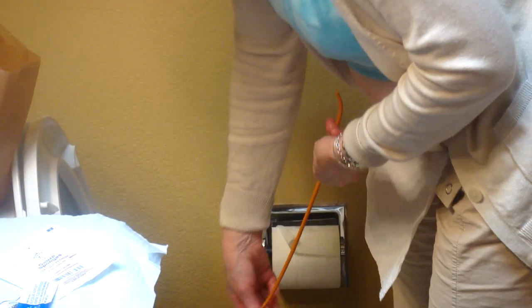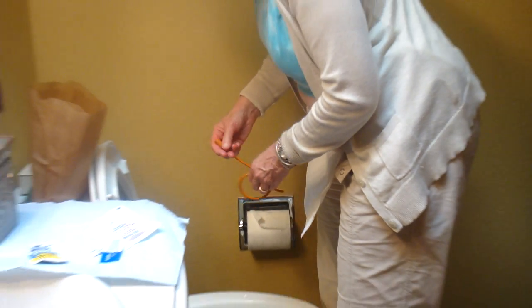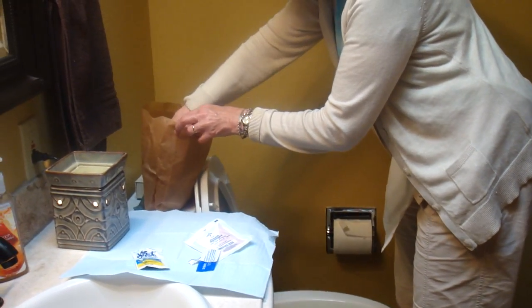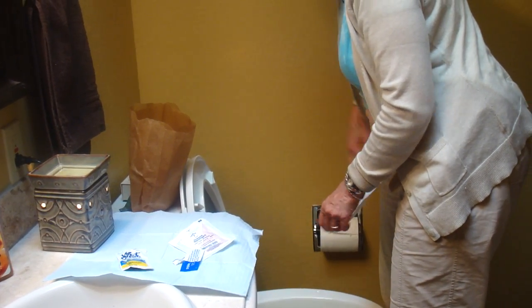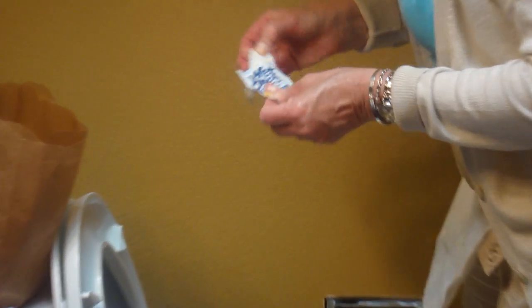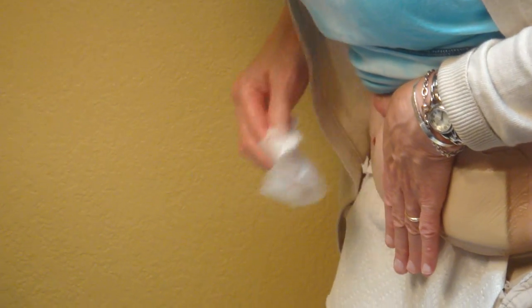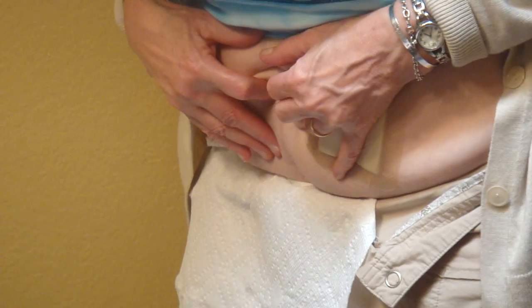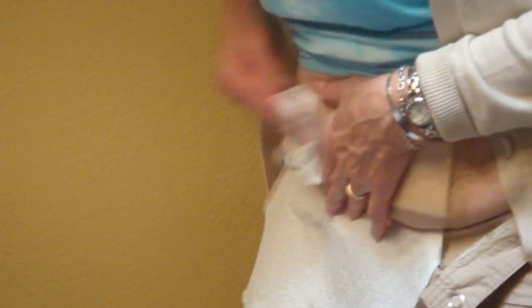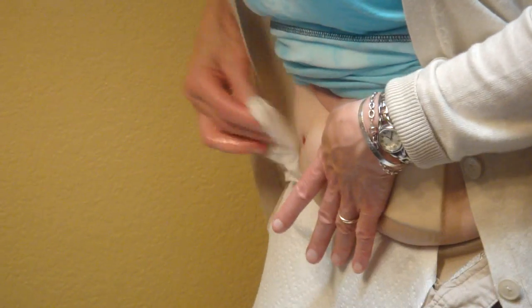I'm going to take this out very carefully because there's going to be a residue that comes out the front. I carry some paper bags to put the used catheter in. At home I put it in a container with some water and rewash them. I'm going to take my wet wipe and just wipe around the stoma area, very gently wiping off that extra lube, and just pat gently on the stoma itself — because I don't want to scrub it. And if you see here, this is my scar from my incision. This is my battle scar — that's always going to be with me, but that's okay.